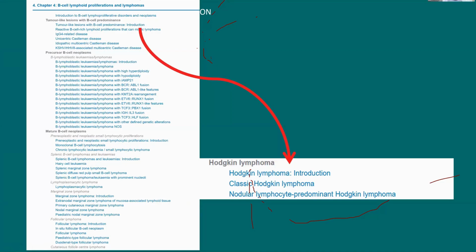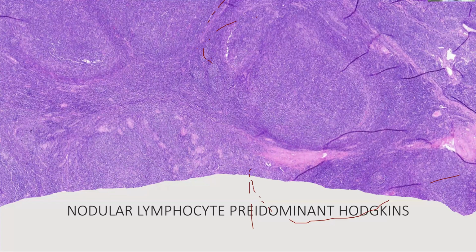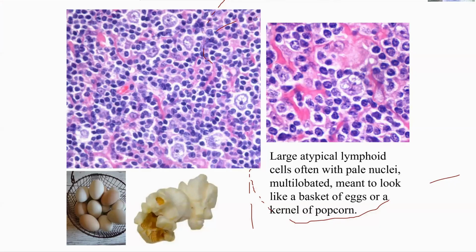All right. So nodular lymphocyte predominant Hodgkin lymphoma, or B cell lymphoma, is, as we said, a different morphology, a different entity. They will withdraw the word Hodgkin from its diagnosis soon. It has three types of cells. You have the large atypical cells, what we call popcorn cells, which are multilobulated, vacuolated cells.